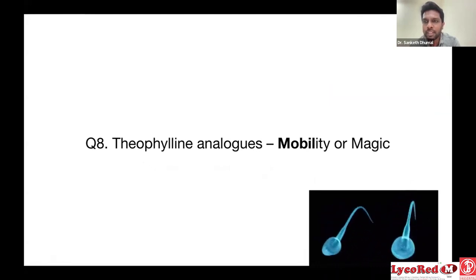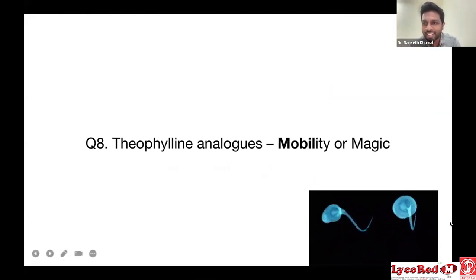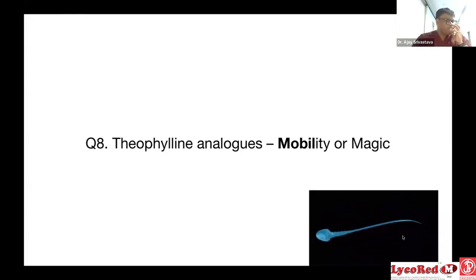Today we had one micro TESE in the morning, the harvest was around 35, and my colleague started catching sperms around 10:30 in the morning. Pickup was at 2 o'clock in the afternoon. She's still catching the sperms. And I had one frozen case where sperms were horrible, and I had only 17 oocytes. I injected and came back early. So yes, it does help in some patients.